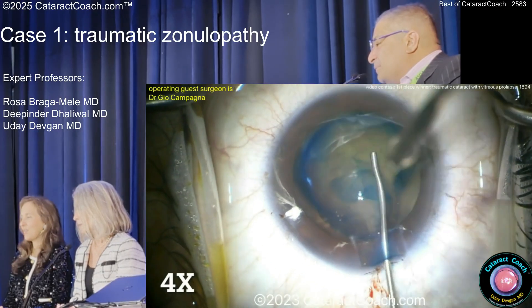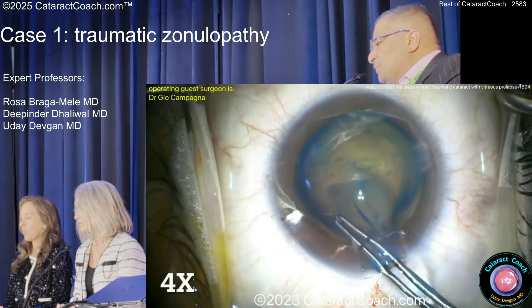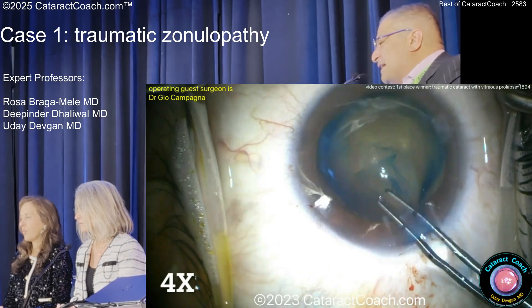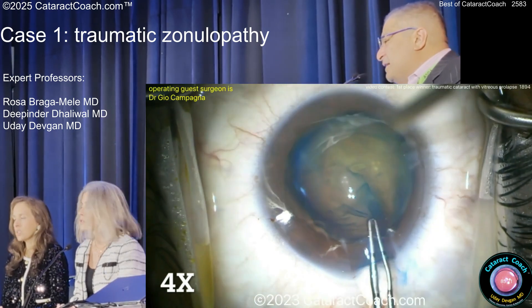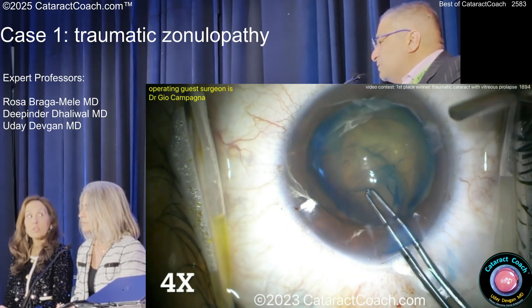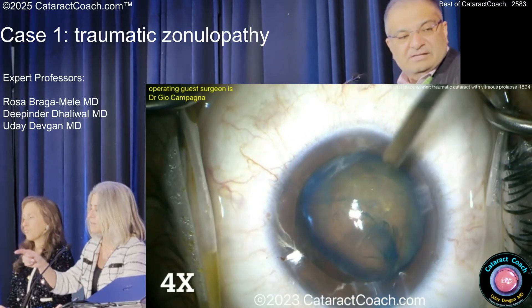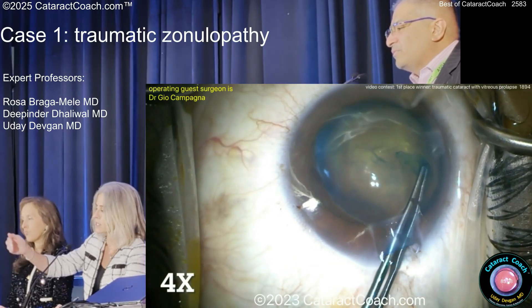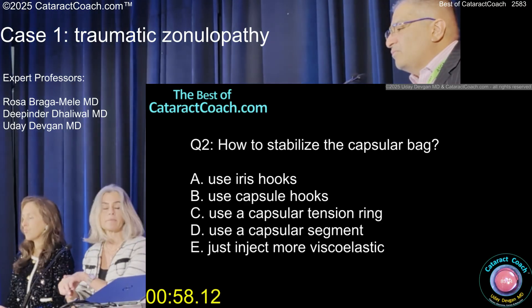Any pearls to get this rhexis done? It's a little tough. When I started to do the rhexis here and grab onto it, it ends up the whole nucleus is kind of moving in. What do you have for a pearl here? You can stabilize the bag — so would you put a hook in now? A capsule hook? You could. I actually would have started my rhexis the other way and then started my capsule hooks, because the zonular instability is on the inferior side, and I would have put capsule hooks in there.